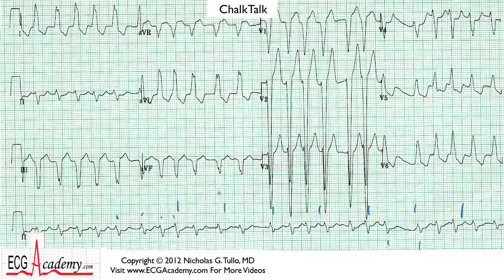Remember that each large box is 200 milliseconds, so it's five boxes per second. I counted off six seconds here, and now we count the number of R-to-R intervals in those six seconds: one, two, three, four, five, six, seven, eight, nine, ten, eleven, twelve, thirteen.